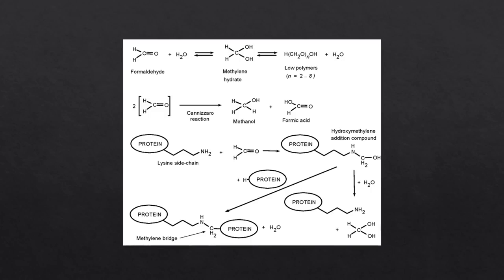However, formaldehyde also has the effect of masking the epitopes on proteins. Although not studied extensively, the effect of masking due to fixation is well known in labs. IHC procedures could not develop successfully for many years because fixation, which we know is crucial for IHC to work, is itself masking and hiding the target proteins by covering up epitopes.